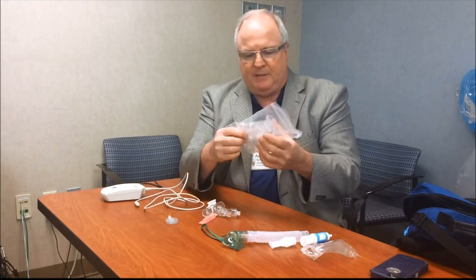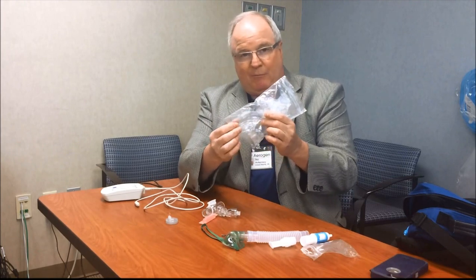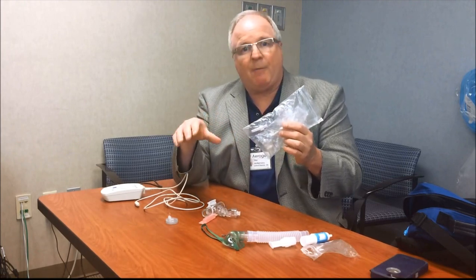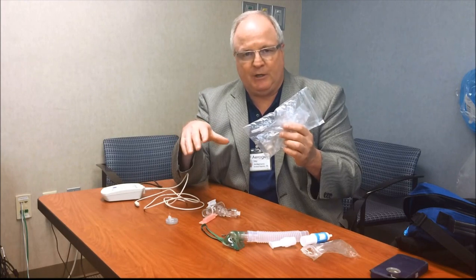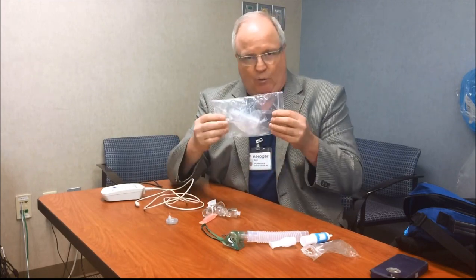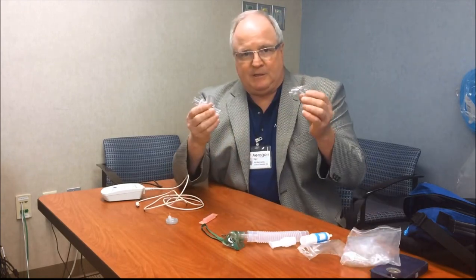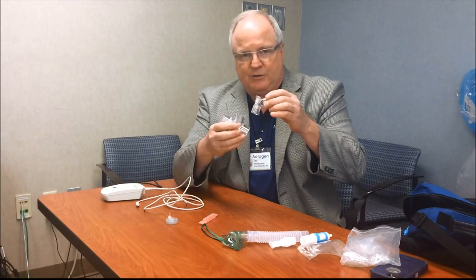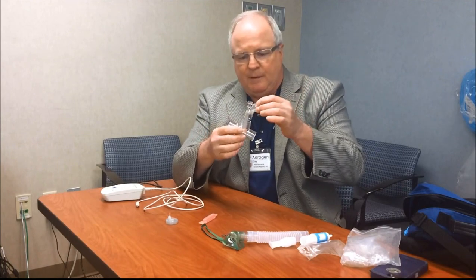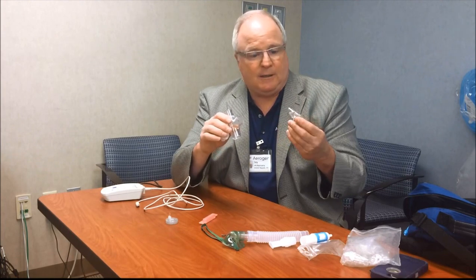There is one other item inside there. It's a luer lock. At this time, you could probably dispose of that. There's another system out there for continuous medication delivery, unless you're directed otherwise by your management. So once you open up this treatment, you will then have these 2 items, the universal T-piece as well as the Solo. And the Solo operates on what's called vibrating mesh technology.